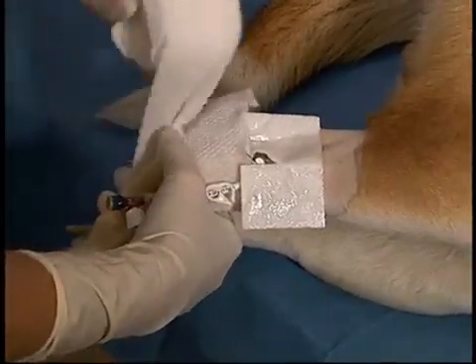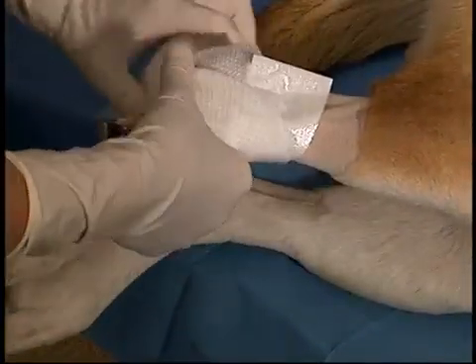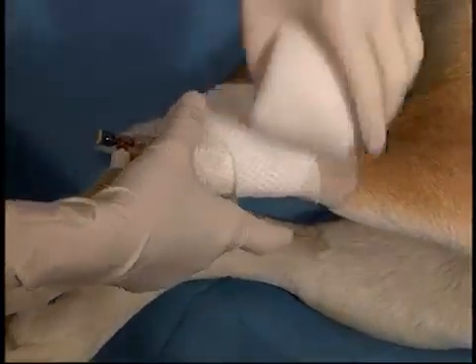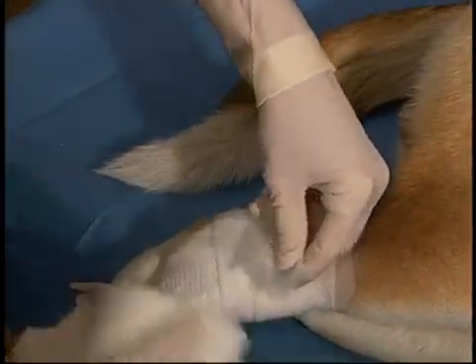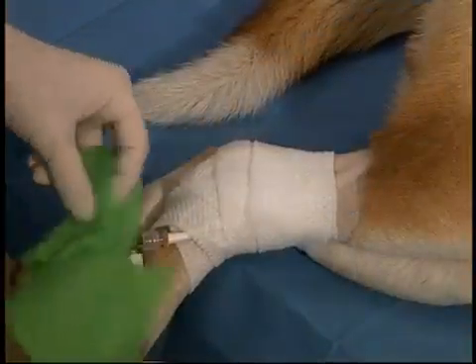Catheters are extremely useful for patients that may be in hospital for multiple days, for those patients that require multiple blood sampling, or for those patients requiring infusion of hyperosmolar solutions. To ensure ease of aspiration for blood sampling purposes, the tip of the catheter should always be up at the level of the vena cava.